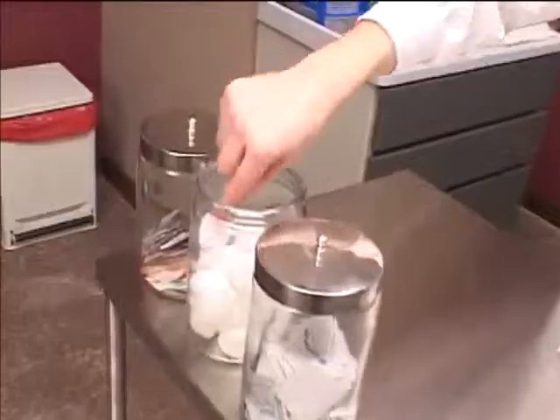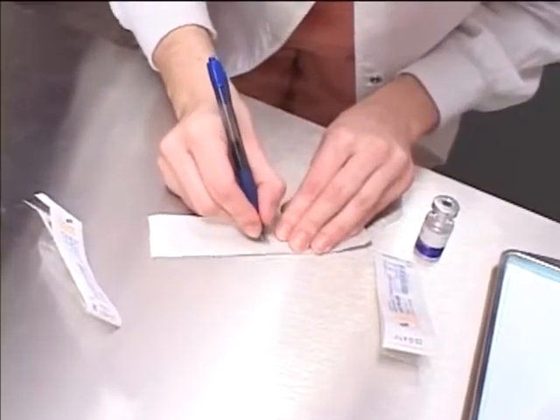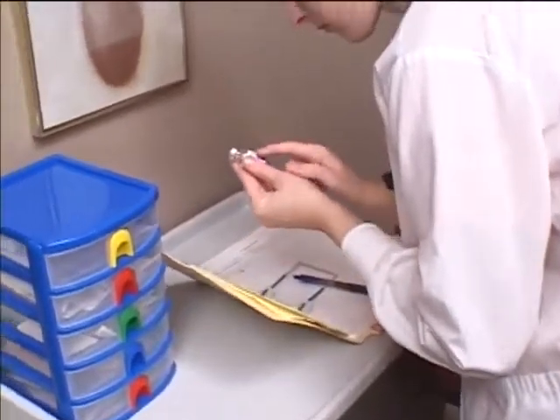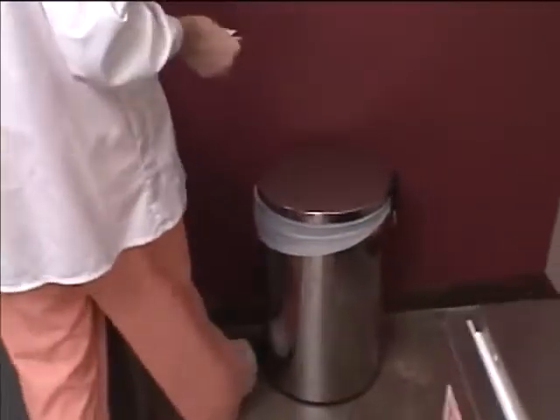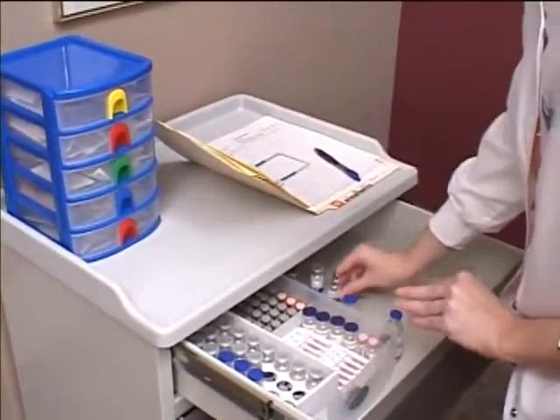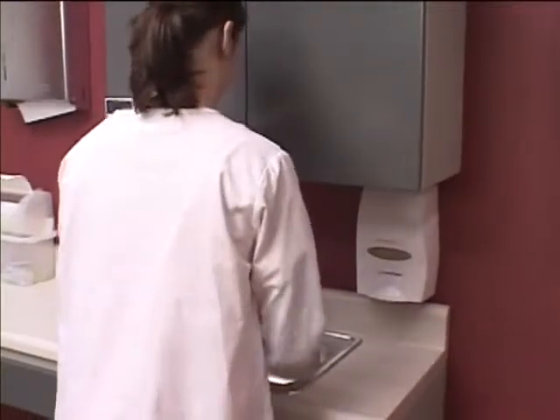Place syringe, cotton balls, alcohol pad, and adhesive bandage onto a medication tray. Label wrapper if necessary with the appropriate information. Recheck the medication against the chart before disposing or returning to the storage area. Dispose of waste in the single-dose vial according to facility procedure. If using a multiple-dose vial, return it to its proper storage area. Finish by washing your hands.